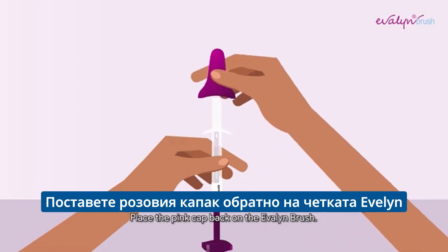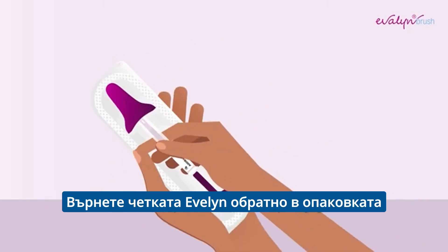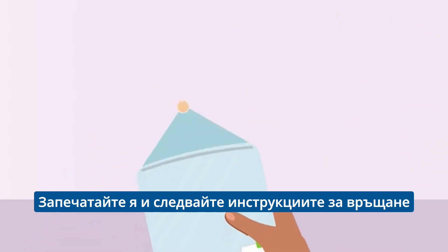Place the pink cap back on the Evelyn Brush. You will hear a click when it is properly in place. Put the Evelyn Brush back inside the packaging. Place the packaging containing the Evelyn Brush into the plastic bag and seal it. Follow the return instructions.